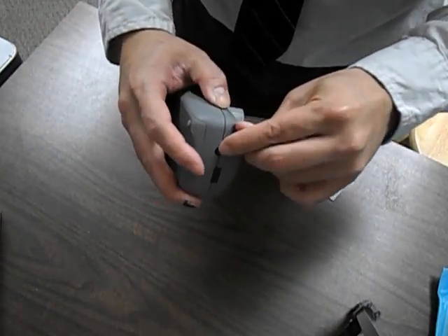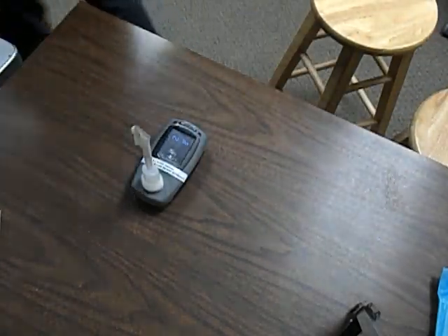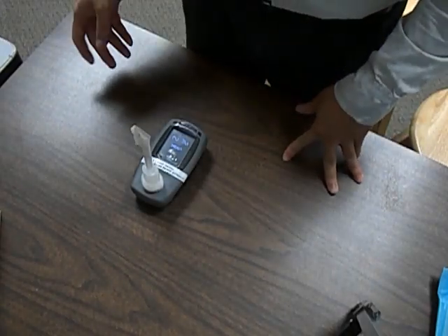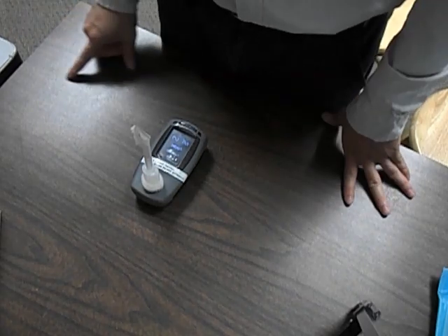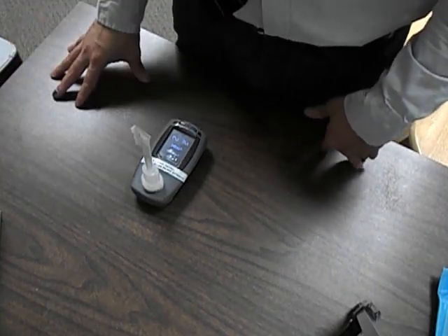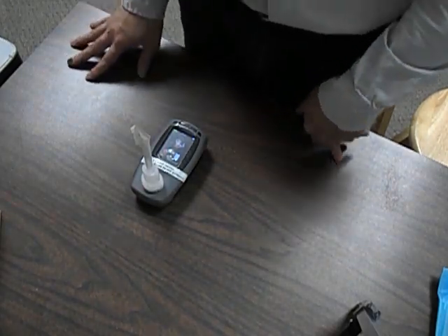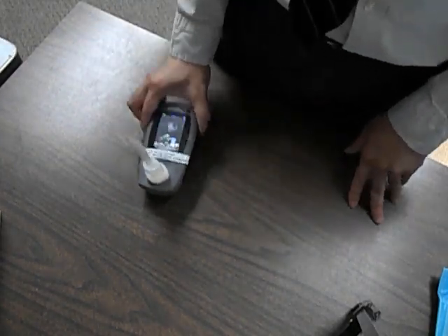The power button is on top to turn it on. The reason why we do the breath carbon monoxide test is because we're trying to look for carbon monoxide levels from smoking. Carbon monoxide also competes with oxygen to bind to hemoglobin, and a decreased oxygen level can alter fetal development.